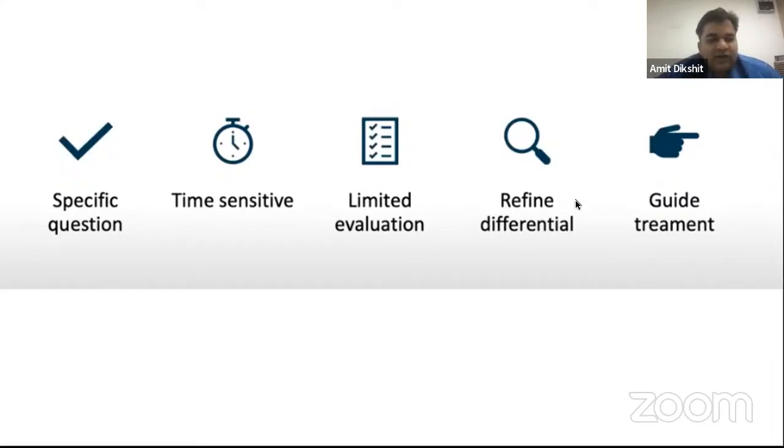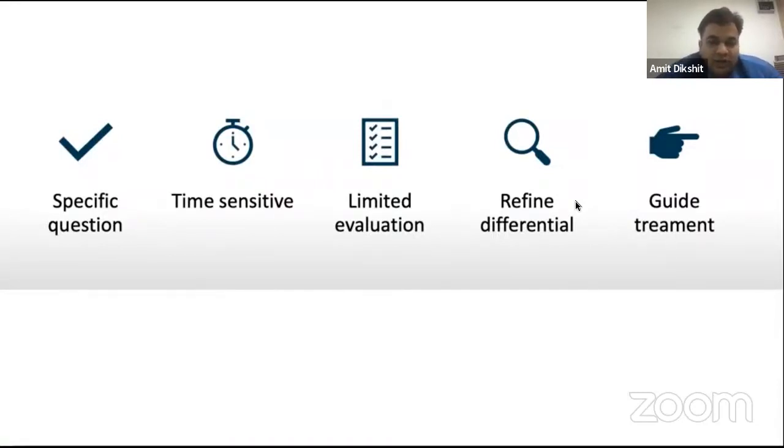We do not assess every time whole of airway for each and every patient. We have some specific question and we help each other by identity. So unless you train yourself to ask a right question, that is a focus question, you will not get the right answer. So it should be a specific question. It is time sensitive. It is limited evaluation, and it is refining the differential diagnosis and guiding my treatment. So whether it is pre-op, whether it is intra-op, cricothyroid puncture, many uses we'll see now, post-extubation stridor. So very specific question, after thyroid surgery, are vocal cords moving or not? Yes or no, something like that. So I'm doing that specific interrogation at that point of time to find answers.